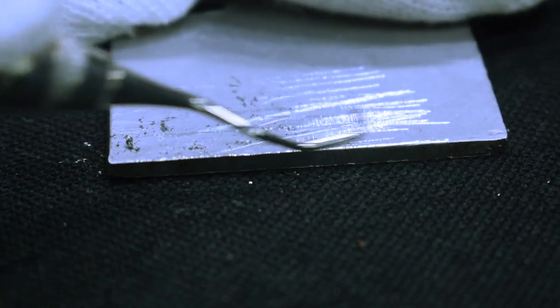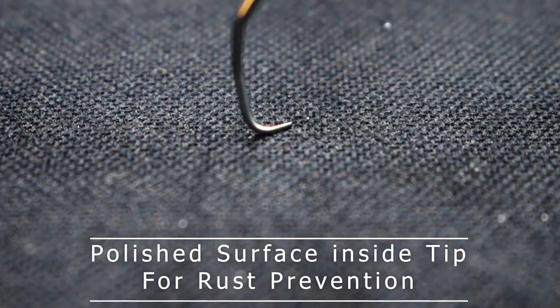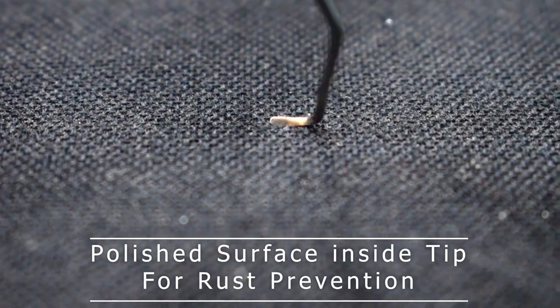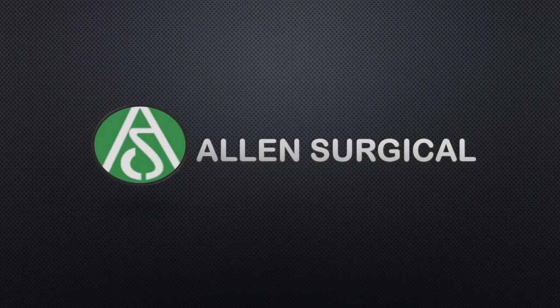Additionally, the lightweight design reduces hand fatigue, while the wide selection of handle designs ensures personalized comfort and control. With long-lasting performance and exceptional outcomes, our dental curettes enhance the efficiency and quality of dental procedures.